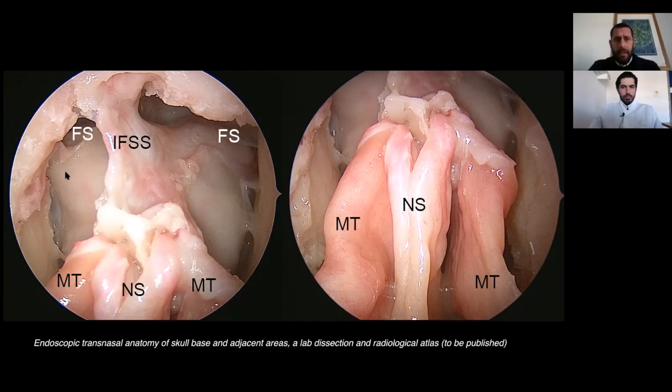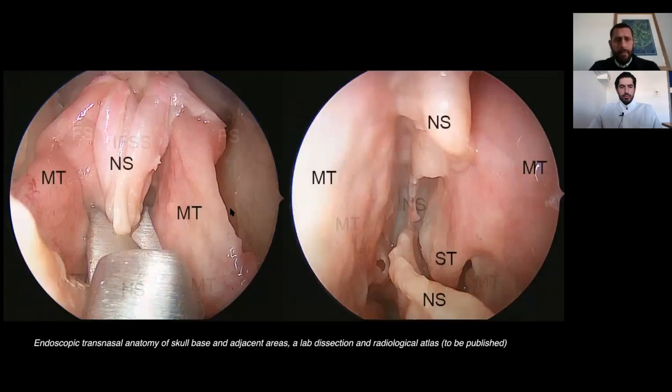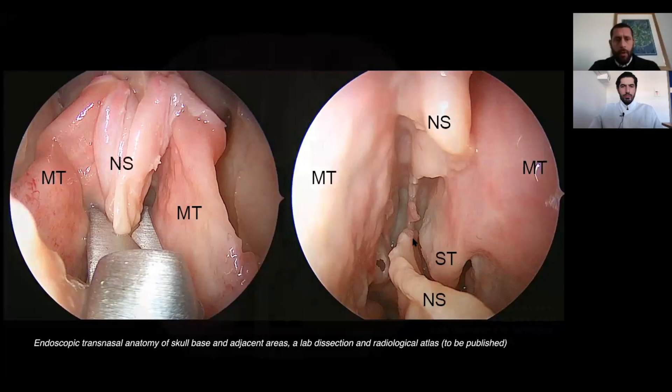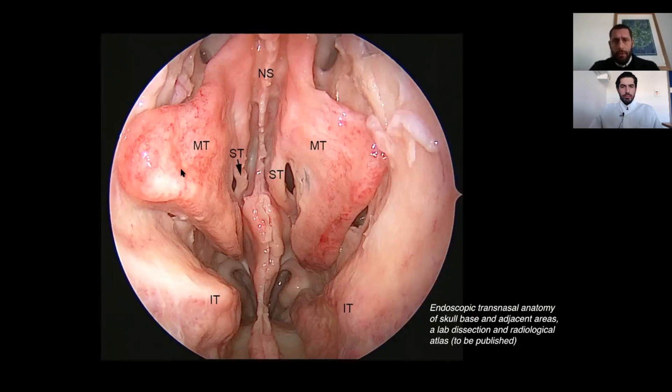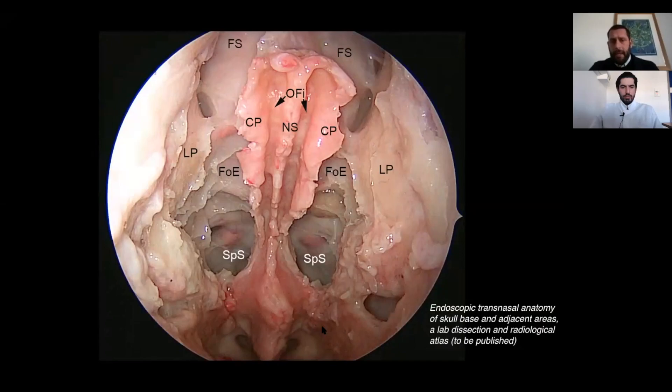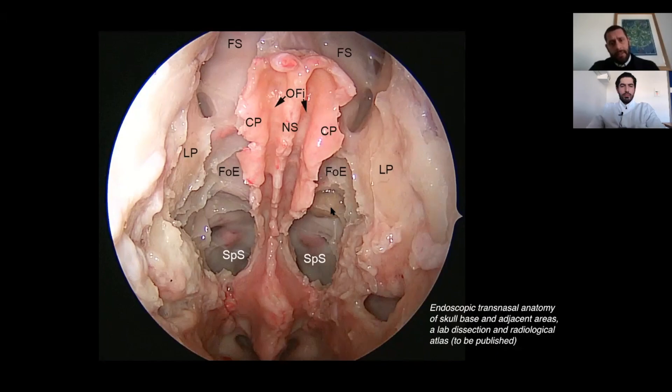Starting from anterior: the two frontal sinuses opening with a Draf III procedure, the nasal septum, and the two middle turbinates. We cut the nasal septum to better expose all the nasal fossa. You can see both middle turbinates, the resected nasal septum, the two inferior turbinates, and the choana. The two middle turbinates and the entire ethmoid complex are removed bilaterally in a centripetal resection. The anterior ethmoid arteries are visible.